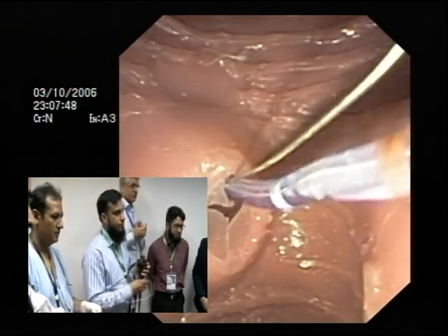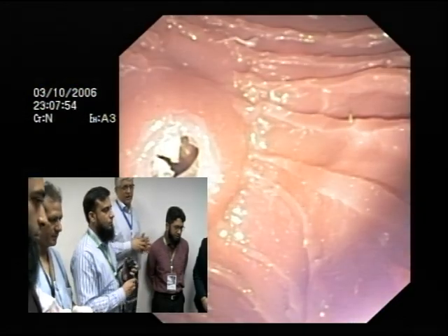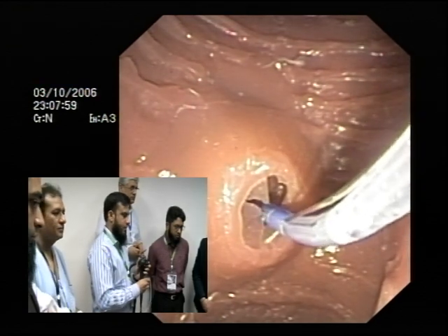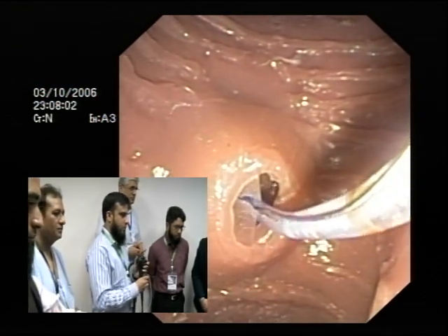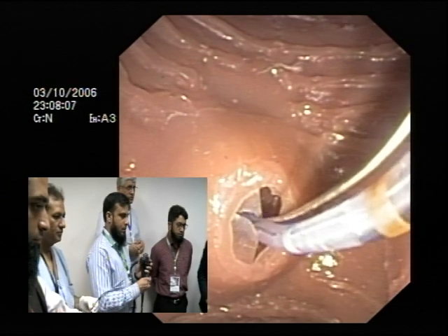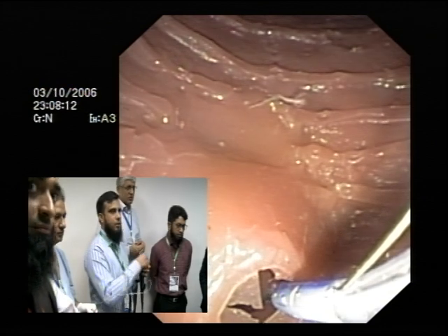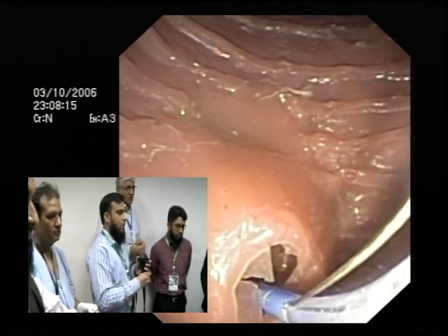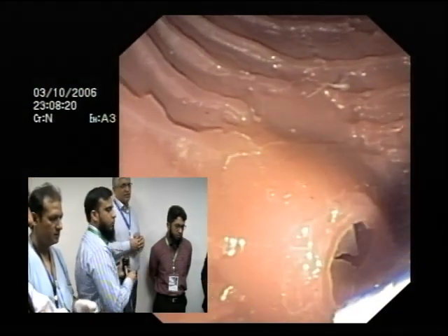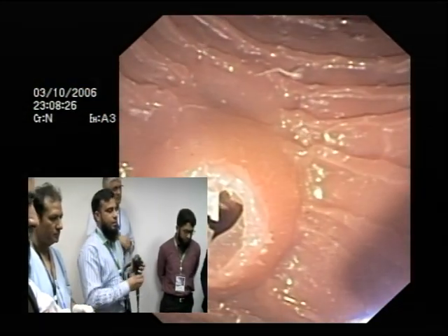Good. Lucky you. So you understand now. Try and get into the pancreatic duct. Okay. So for the pancreatic duct again. Bring the ampulla close to you. Big wheel back? Good. I want it to be a little bit on the right of the screen. On the right? Yeah. So yeah. Good.